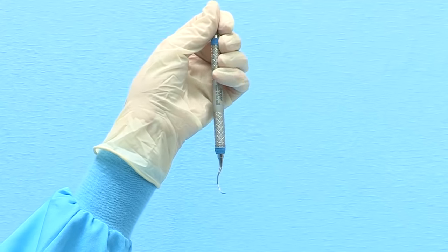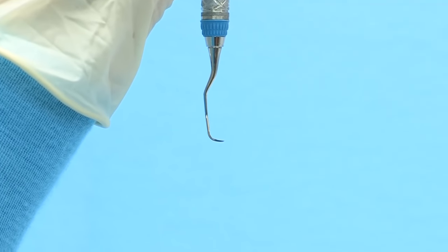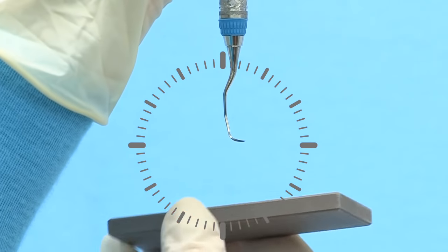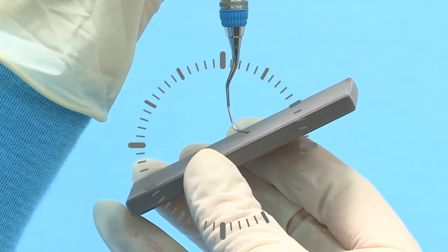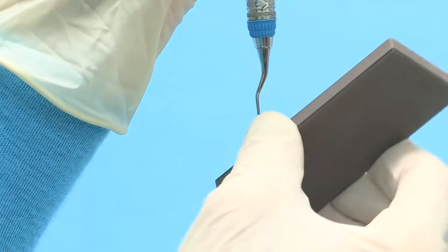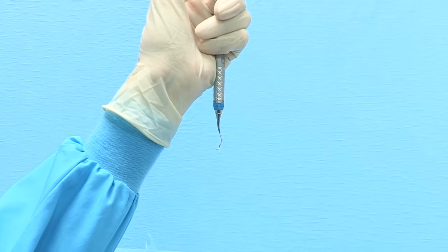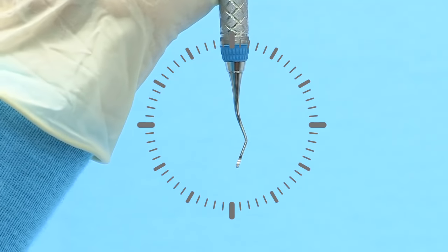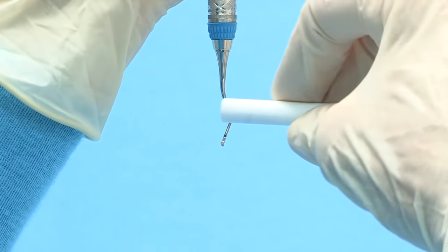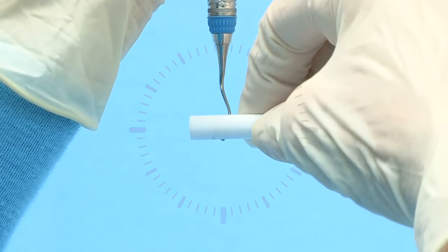When rounding the toe of the even-numbered Gracie curette, rotate the instrument so that the toe is pointed at 3 o'clock with the face of the instrument parallel to the table surface. Position the stone underneath the blade at 3 o'clock and tilt the stone upward to the 2 o'clock position. Move the stone in a consistent motion, overlapping strokes and rotating around the toe to maintain the rounded shape. To finish the facial surface, hold the terminal shank at 3 minutes after 12 o'clock with the toe pointed toward you. Position the cylindrical stone along the face of the blade horizontally at 3 and 9 o'clock, then lightly roll the stone along the face of the blade from heel to toe.